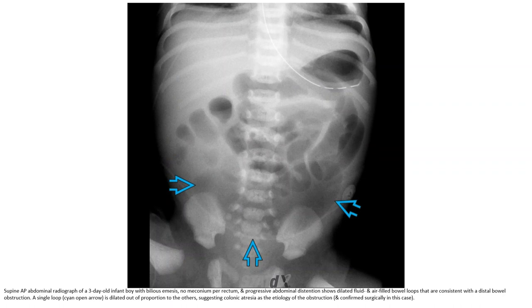Supine AP abdominal radiographs of a three-day-old infant with bilious emesis, no meconium per rectum, and progressive abdominal distension show dilated fluid-filled bowel loops consistent with distal bowel obstruction. A single loop is dilated out of proportion to the others, suggesting colonic atresia as the etiology of the obstruction, which was confirmed surgically in this case.